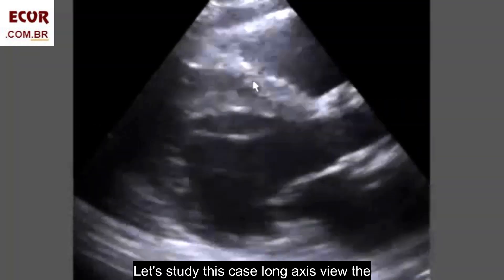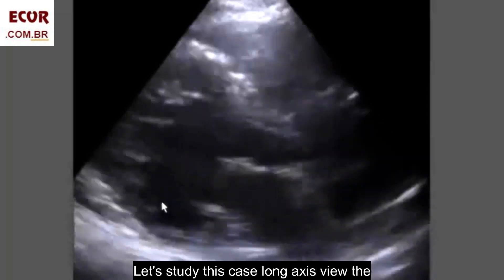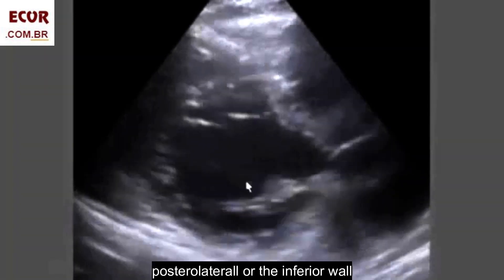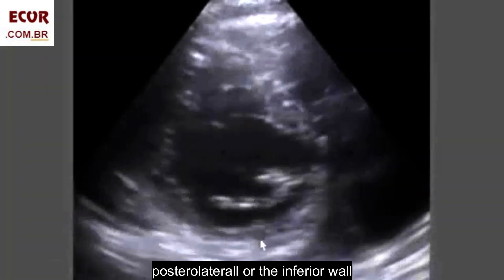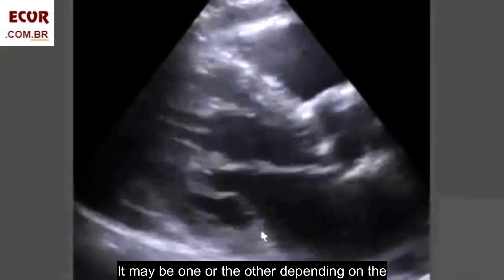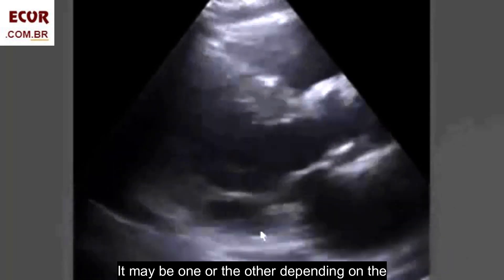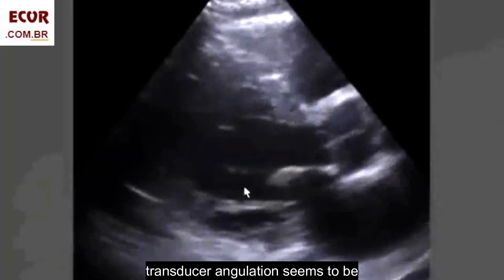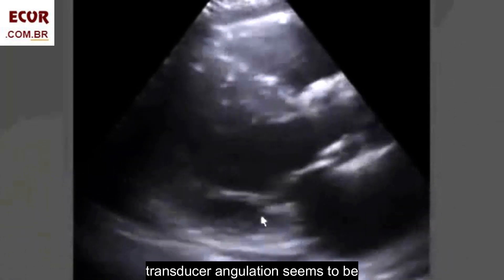Let's study this case in the long axis view. The posterior lateral or the inferior wall — it may be one or the other, depending on the transducer angulation.